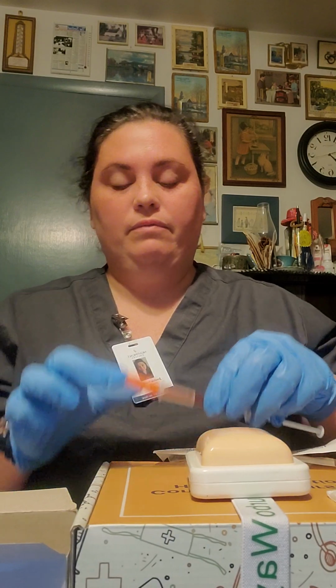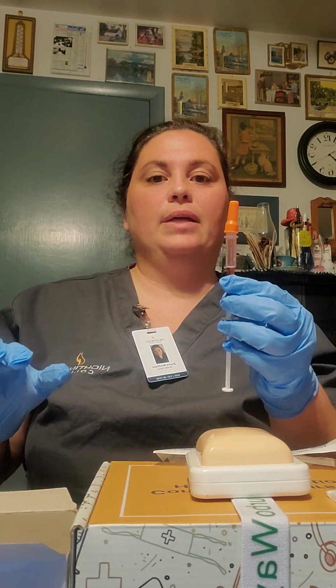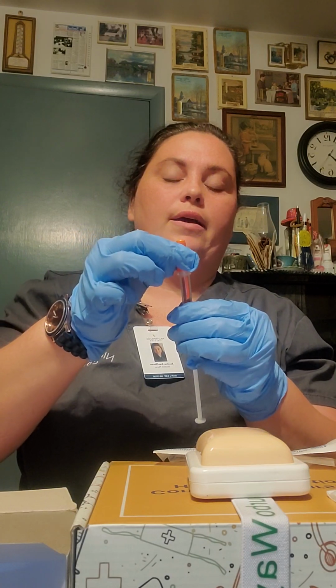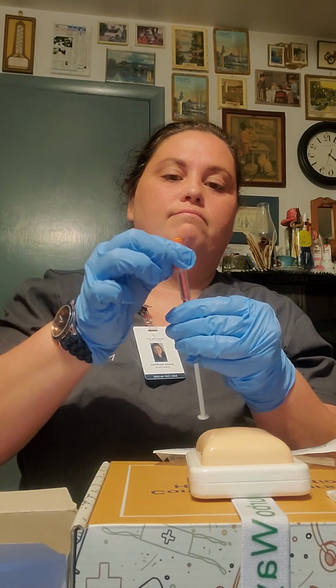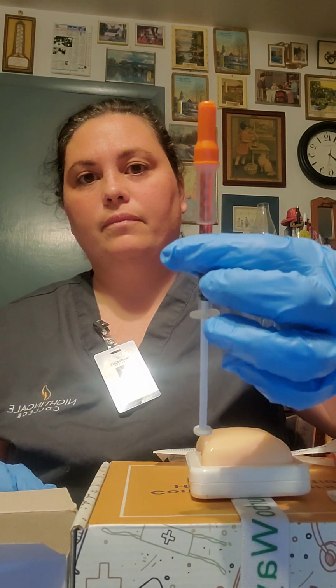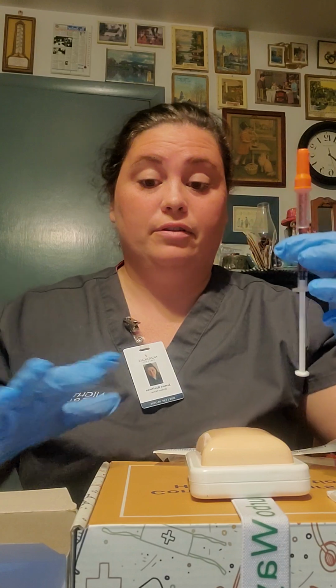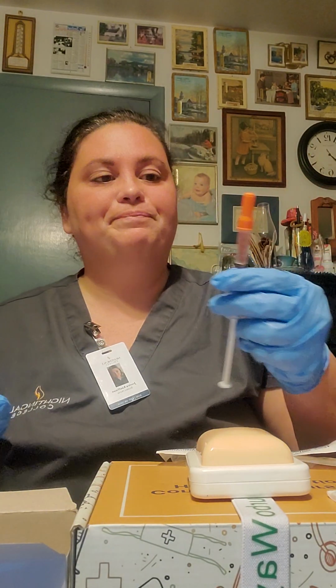Then I'm going to recap by scooping. Oops. Not by doing that. This surface isn't very flat. Alright, I'd scoop it up like this, and then I would push down here on the cap. Alright, in the real world that wouldn't go flying because I'd be on a flat surface. I have my thing on my box here, so it was a little wobbly.